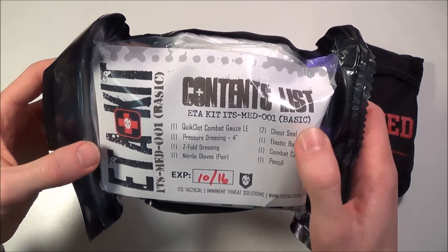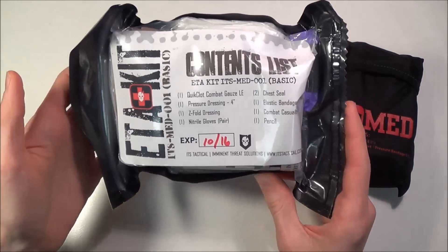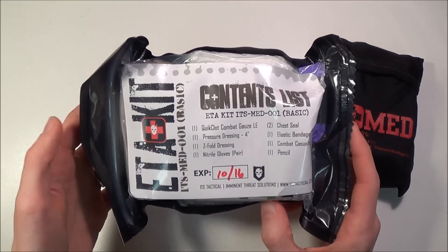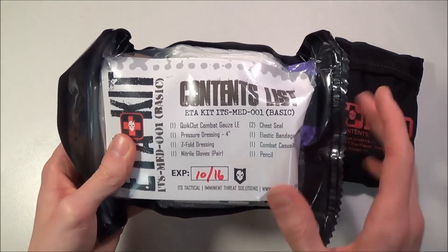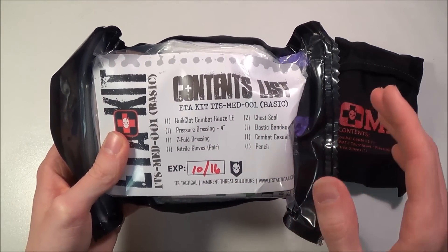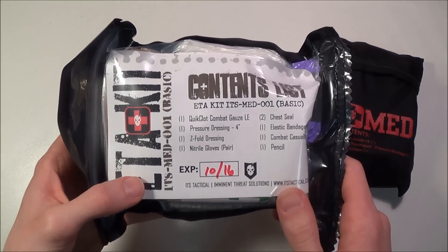I think the basic is about $20 cheaper. This kit ranges from $100 to $120 — the $100 version is the basic, and $120 is the one with the decompression needle and the nasal pharyngeal airway.